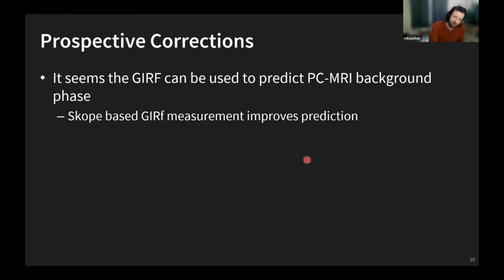And that itself could be used as a correction method. If we just know what the background velocity is, we can just subtract it. There's still some problems there, especially if you're sampling a point that has a really steep slope. You can pick the TE point, but on either side of the TE you still have some field going up and down that might be a little harder to correct. And if you're sampling at a point with a really high slope, even if you're off a little bit on your timing, you could still get too much error.